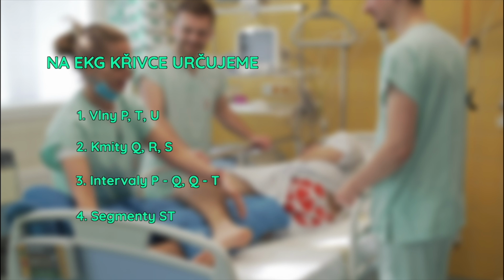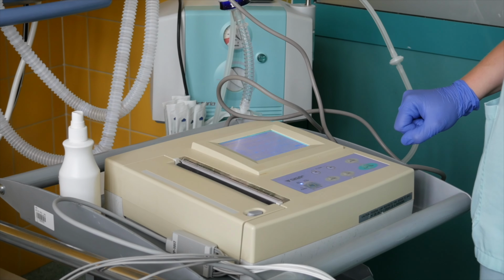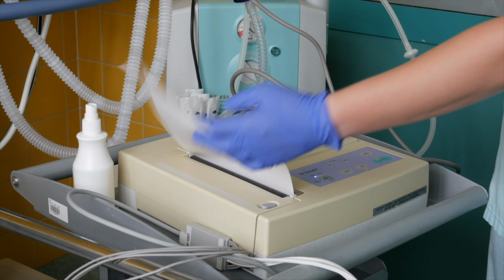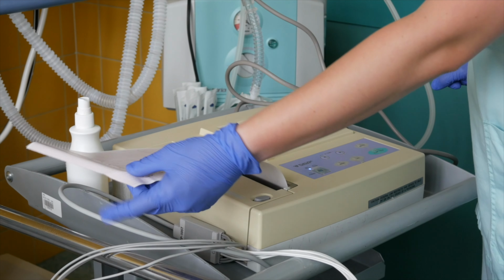The isoelectric line is a horizontal baseline on the ECG without vertical deflections. Under normal circumstances, short segments of the isoelectric line alternate with deflections that arise due to the propagation of the electrical impulse through the heart muscle. These include the P wave, the QRS complex, and the T wave. A persistent isoelectric line appears during cardiac arrest with immeasurable electrical activity.